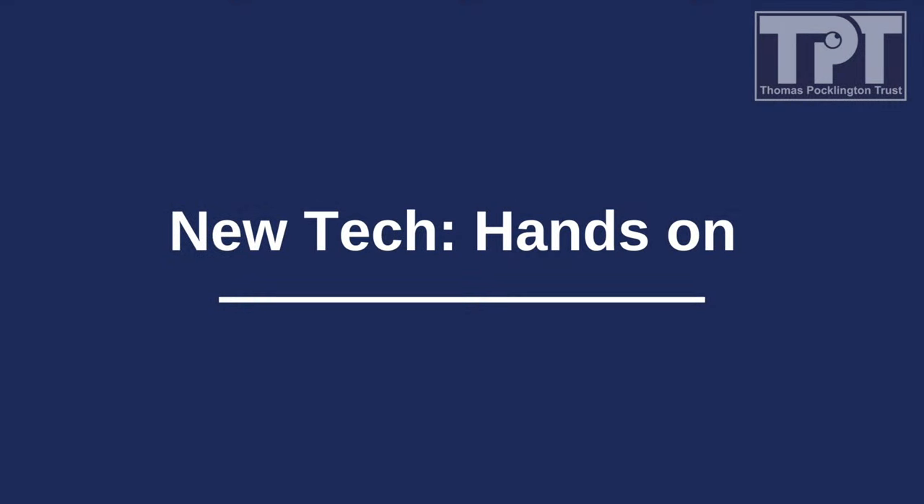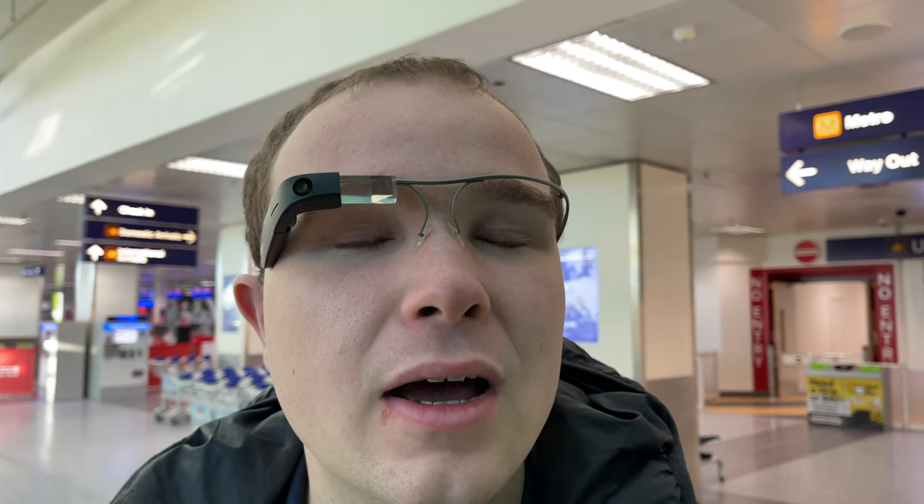Thomas Pocklington Trust — New tech, hands-on. Hello and welcome to a very cold Newcastle International Airport. Today, I'm wearing the Envision Smart Glasses and we're going to take them on a flight to London Heathrow to find out how good these glasses are at helping you navigate complex environments independently. For Thomas Pocklington Trust, I'm Peter Hayton and together, let's go hands-on with the Envision Smart Glasses.